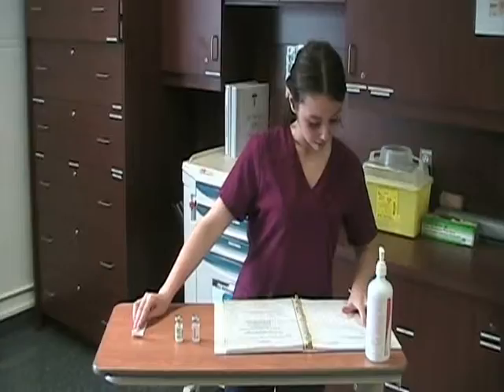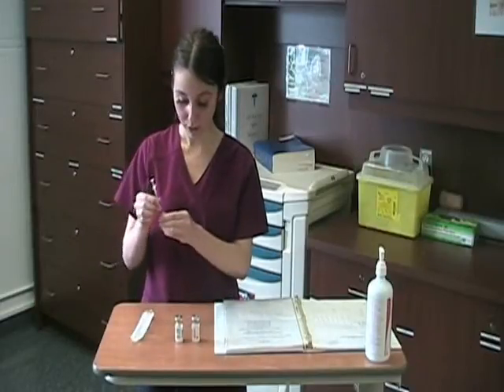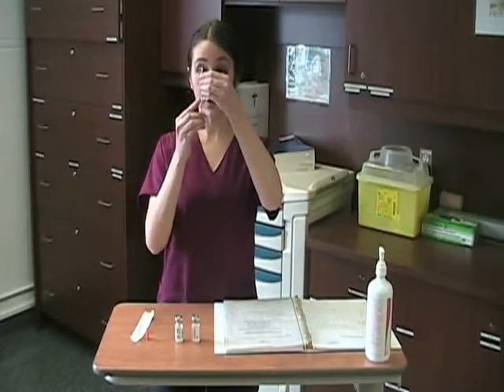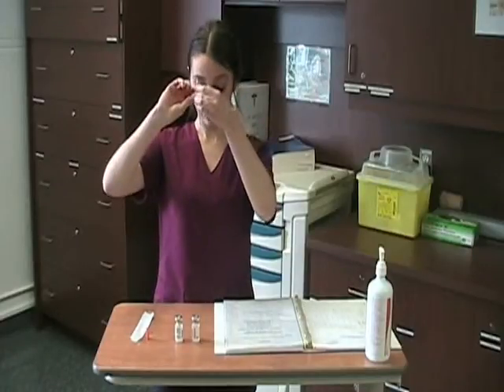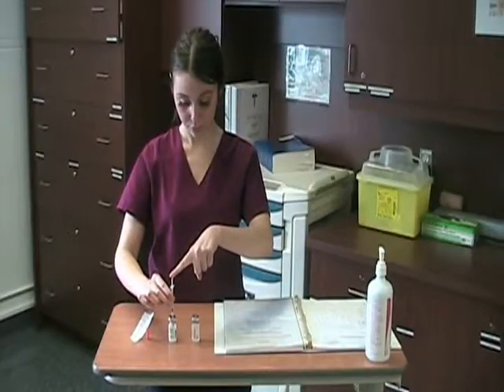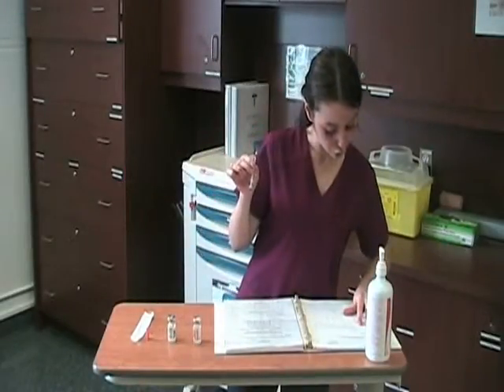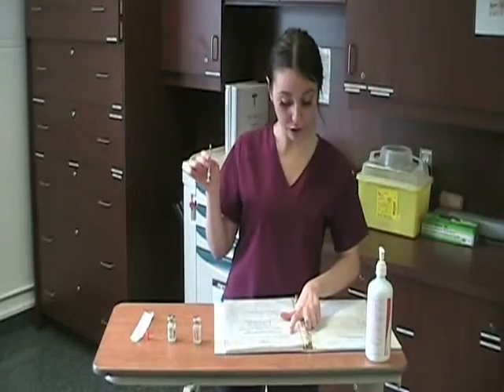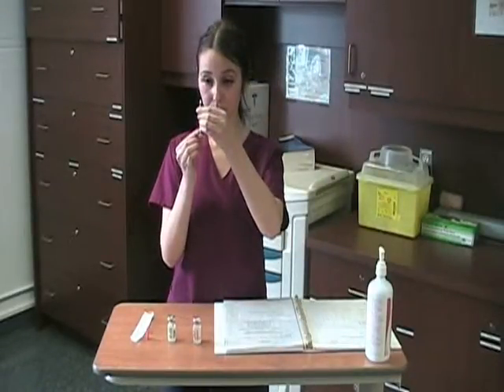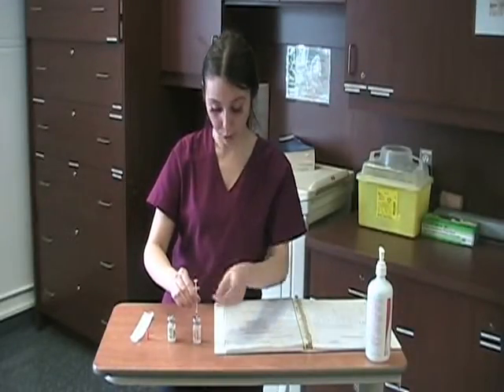For Humulin N, I have to administer 30 units — this is the slow acting insulin, so I inject 30 units of air into it. Then we check the Humulin R: my patient's sugar level this morning was at 14, which gives me four units of Humulin R, the rapid acting insulin. So we're going to insert four units of air into the rapid acting vial.